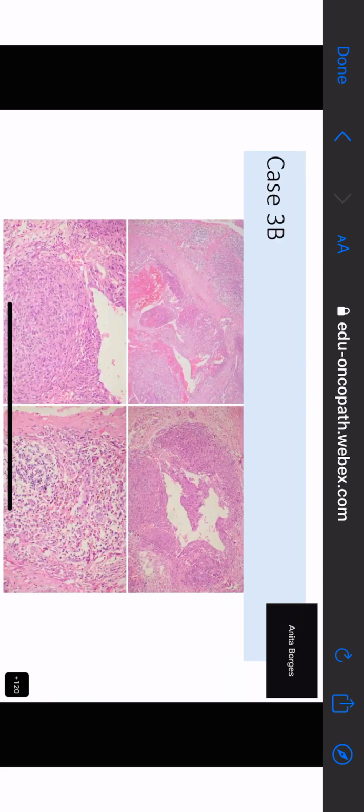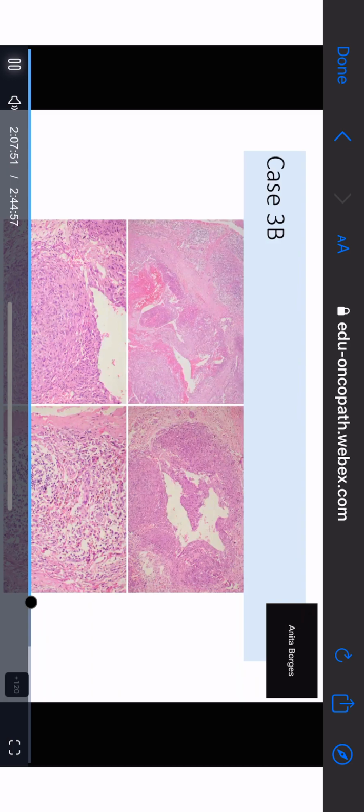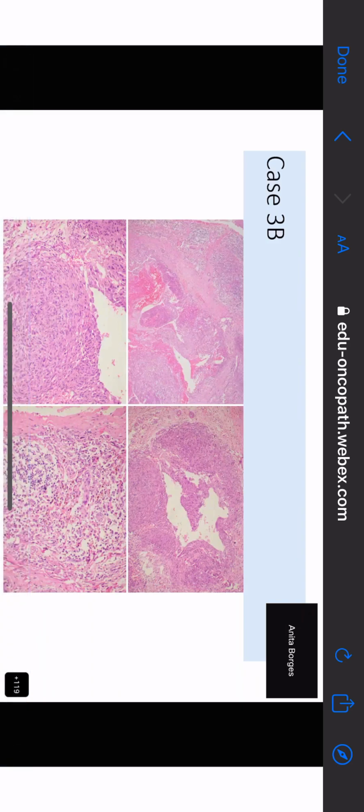All right. So now we come to 3B. Come on, Vimi. You see this? Now just like we described there, put it into one sentence. What you are seeing, and then you will reach the diagnosis. This is an 8-year-old child with a recurrent lesion in the arm, which is nodular, which has cells with a minimum amount of pleomorphism.